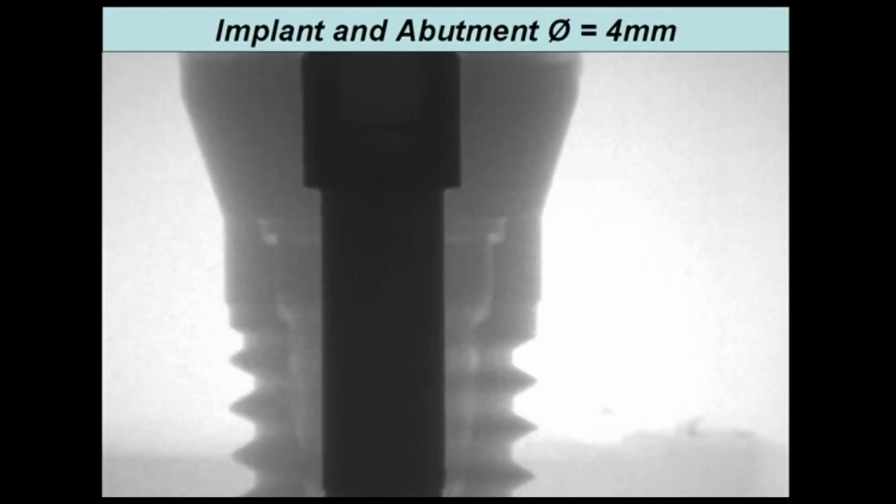The reason for this is elastic deformation of the implant components, not only of the binding screw. So let's look at the videos again, and please don't look at the region where the micro gap occurs. Please look at the implant wall on the left side. You will see a really elastic deformation of the implant wall, and this is the reason for the large micro gap.